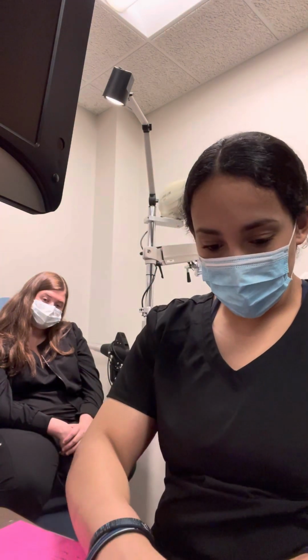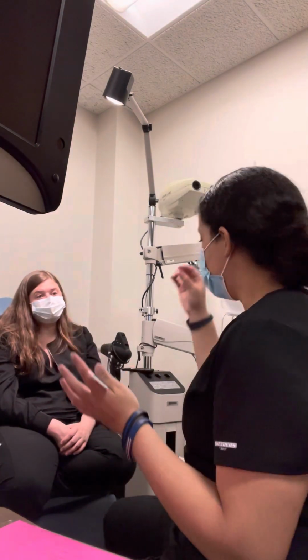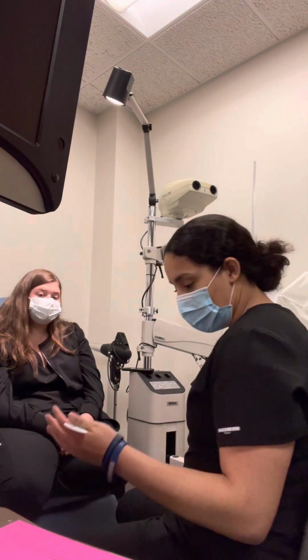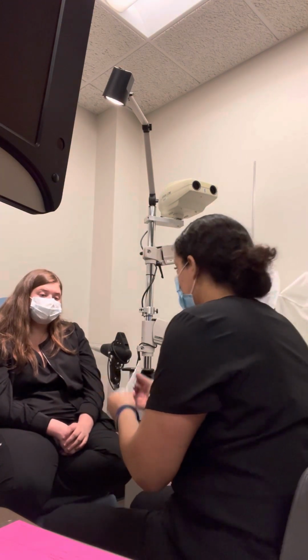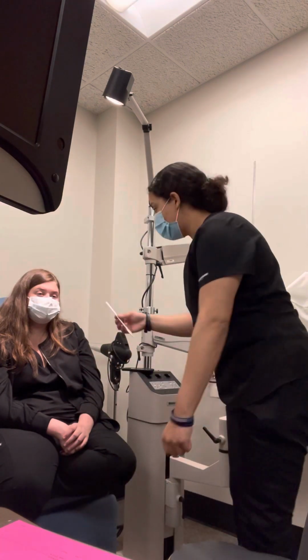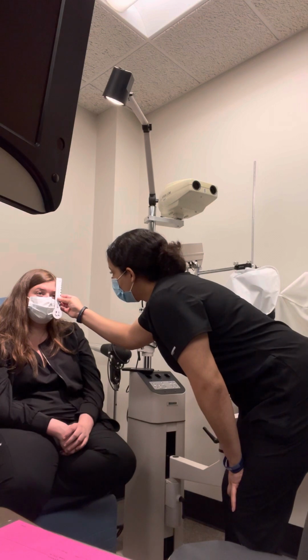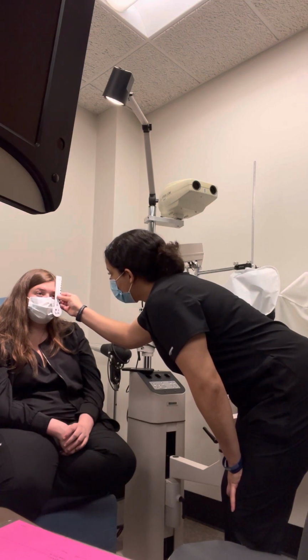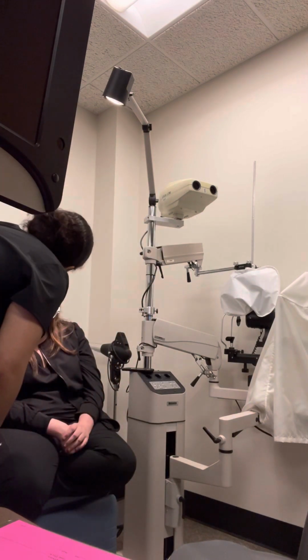Okay, Mrs. Barber. Next, I'm just going to be looking at basically the distance from your upper and lower eyelids, and then checking your pupil size and light, okay? Go ahead and stare at that screen for me over there. Now that you can see your up close vision here, grab that card. Okay, cover your left eye again with that.